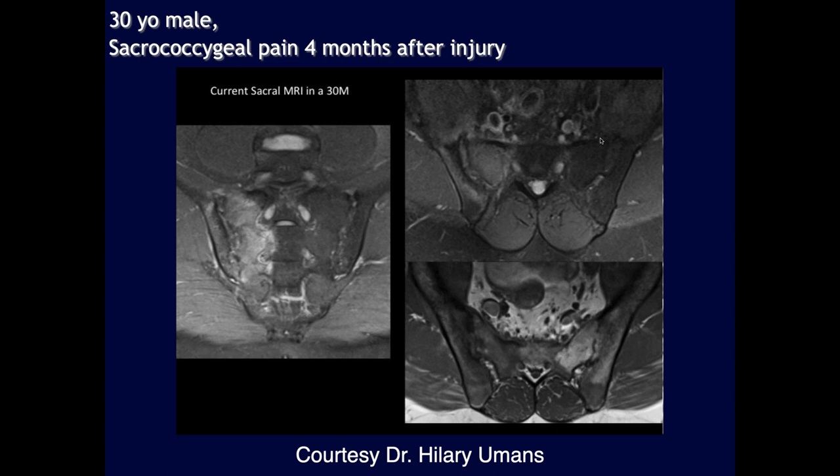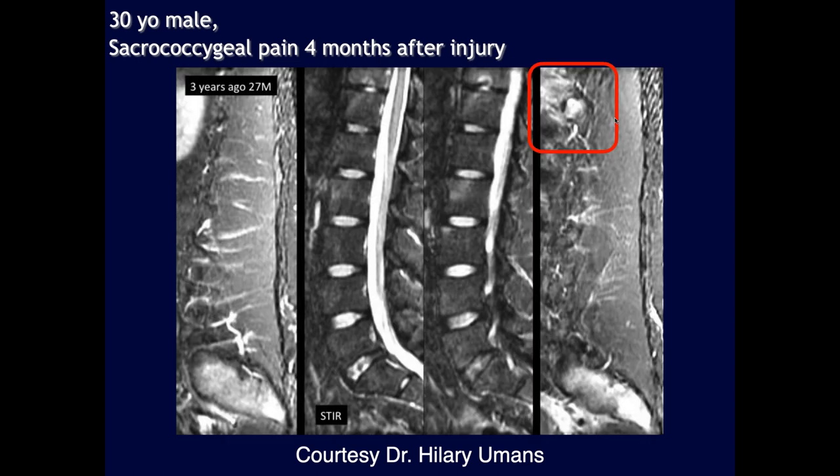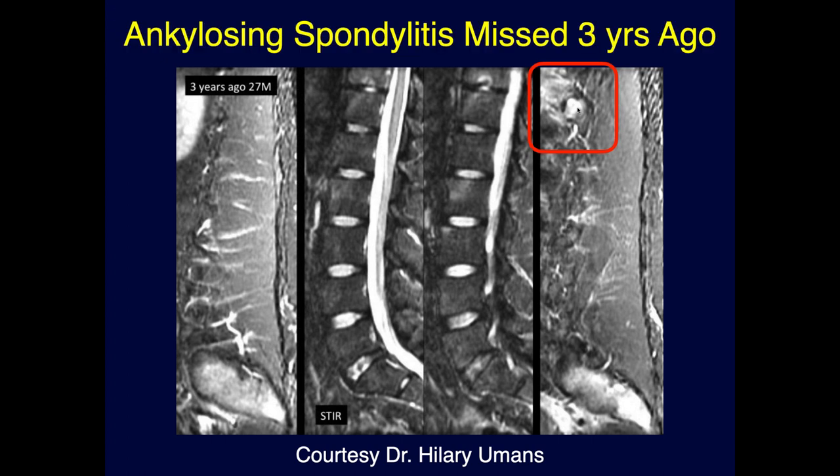Now here we have some edema surrounding the right sacroiliac joint and also along the left sacroiliac joint. Looks like perhaps some early ankylosis on the left. This can be seen with ankylosing spondylitis. That's the calcification of the posterior longitudinal ligament. This is actually the 12th rib. So this is inflammation of the joint between the rib and the vertebral body, which is common in ankylosing spondylitis.